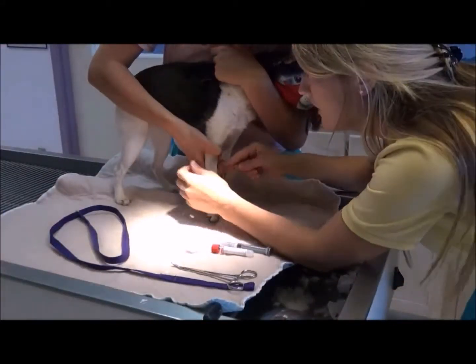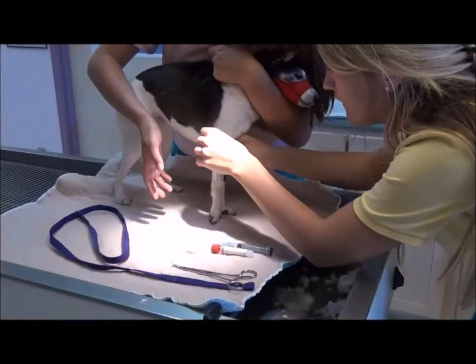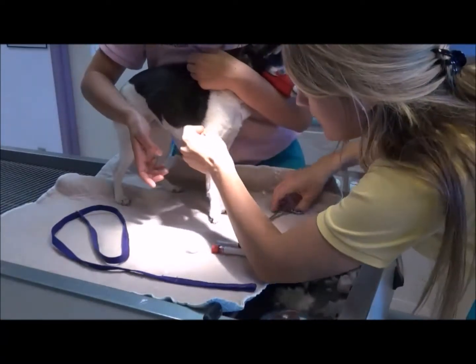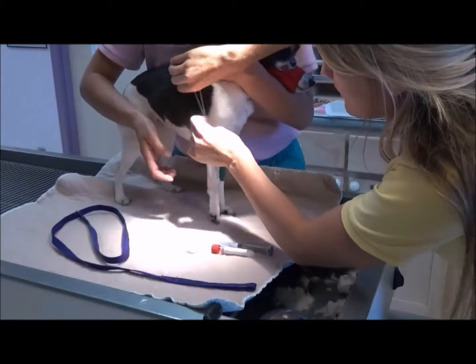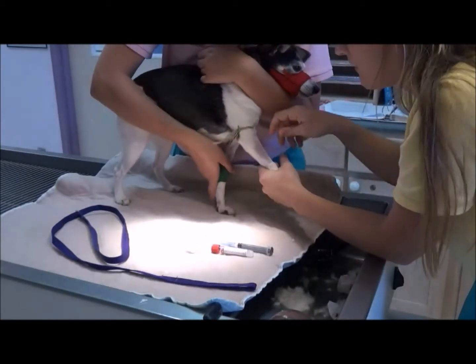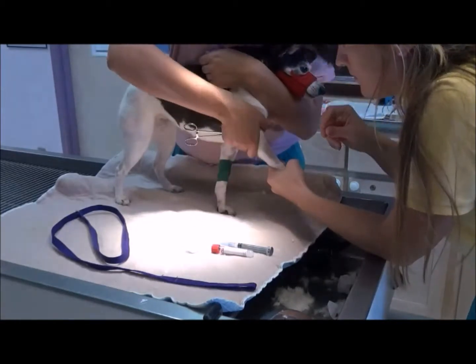Okay, now I'm going to collect a blood sample from the cephalic vein of our canine patient. I pre-clipped the area, and now I'm placing a tourniquet on the leg. I'll have you hold right behind your elbow.